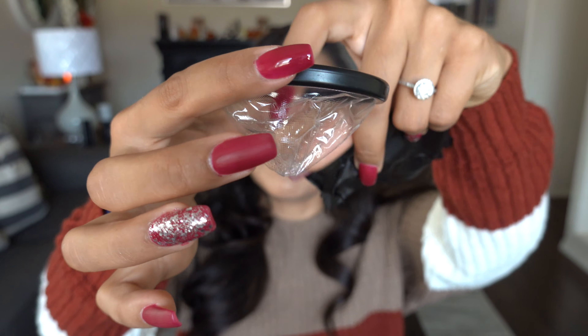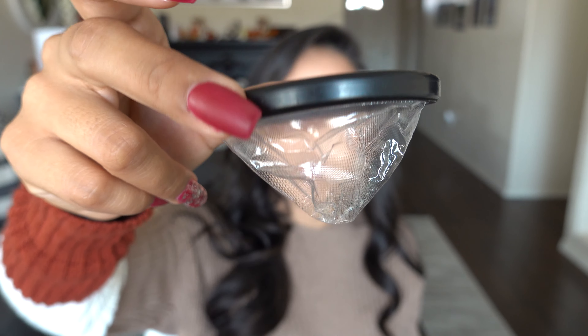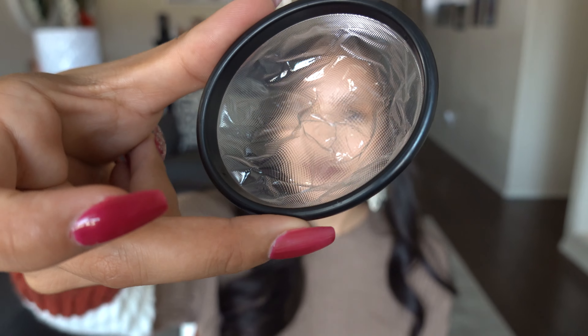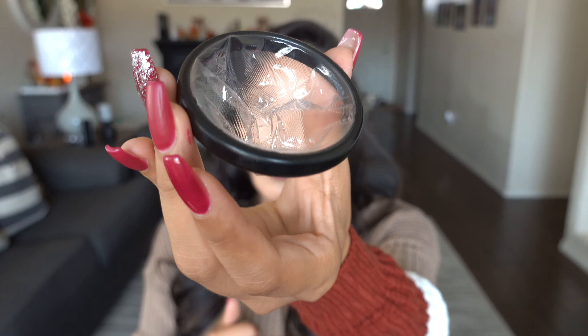When you pull it out of the package, this is what the disc itself looks like. It is flexible and it has the catch bag on it. If I push that down, you'll see the little catch bag that is going to catch and hold the fluid when it comes out. There is a right and a wrong way to put this in.